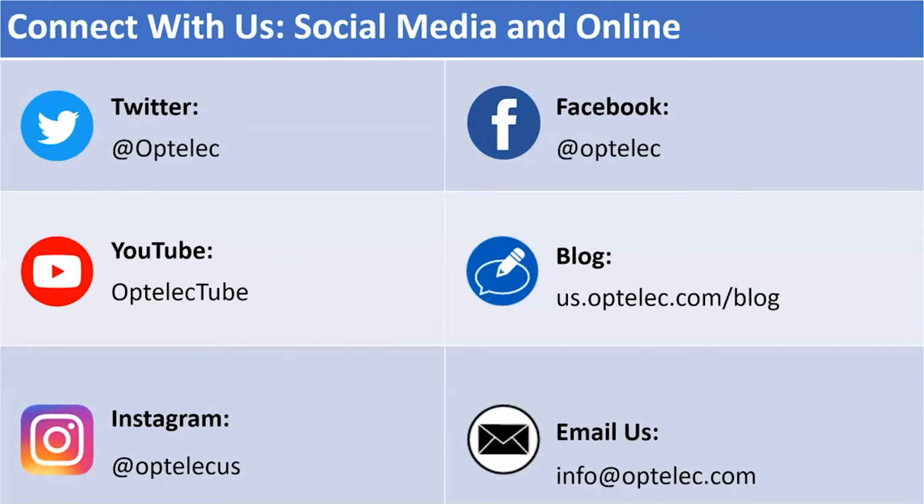And similarly with the smaller devices, if a Compact 10-inch device feels too big, they have a Compact 6-inch device that rather uniquely doubles up as a virtual reality headset. So if you were wanting to use these types of devices for watching television, the Compact 6, the smaller one, can be adapted to wear, much like a VR headset.